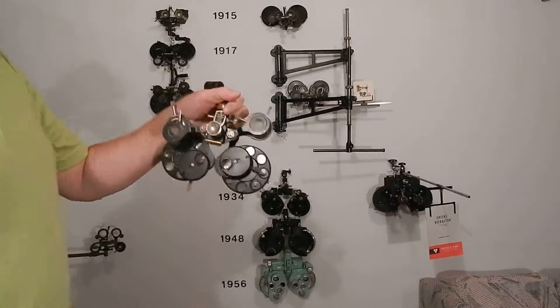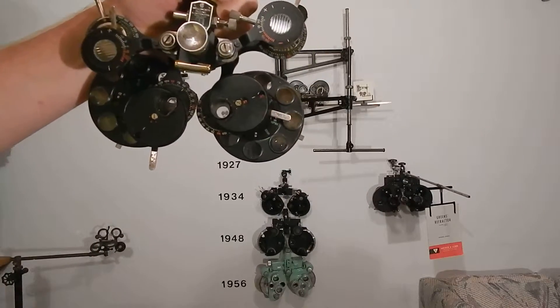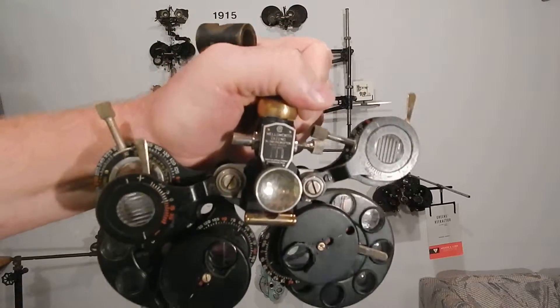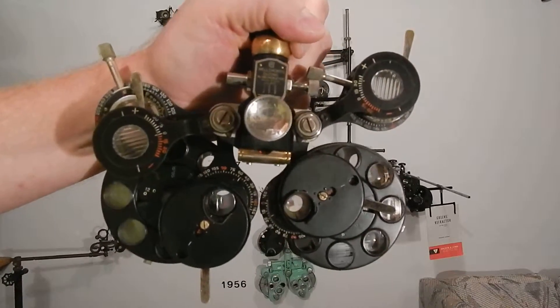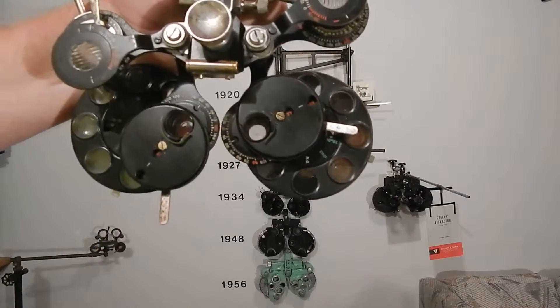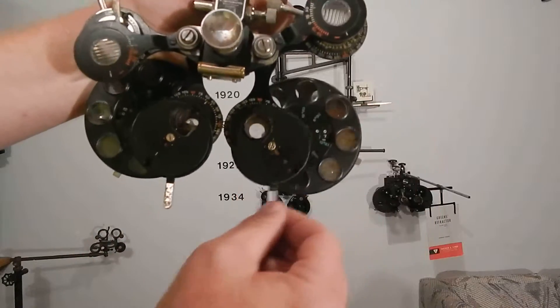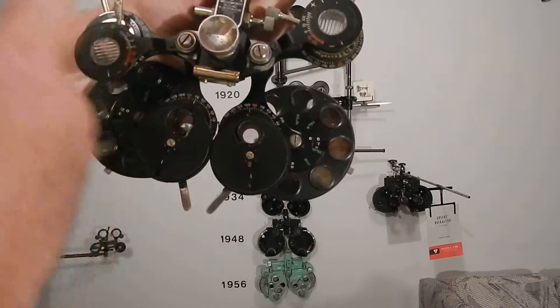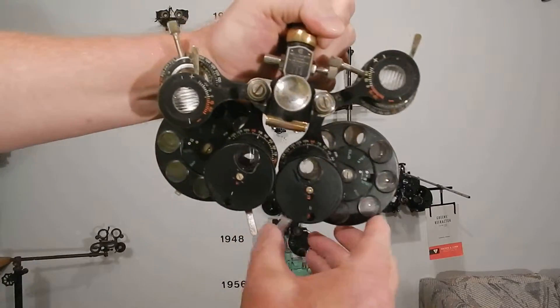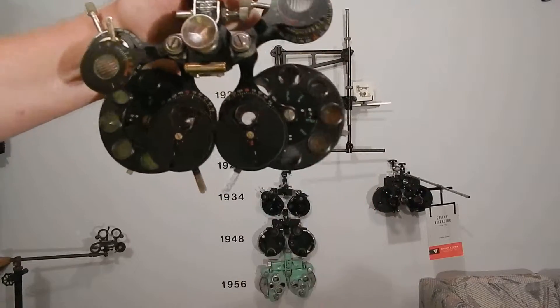The American Optical version is called the 'Wellsworth,' which is the AO trademark. 'Zeng' is the de Zeng trademark. 'Phoropter' is the de Zeng trademark. All the lenses are on the outside — presumably to make them easier to clean. The mechanism is the same: cylinder, Risley prism, Maddox rods. There are no Jackson cross cylinders — you still have to do it the old-fashioned way.